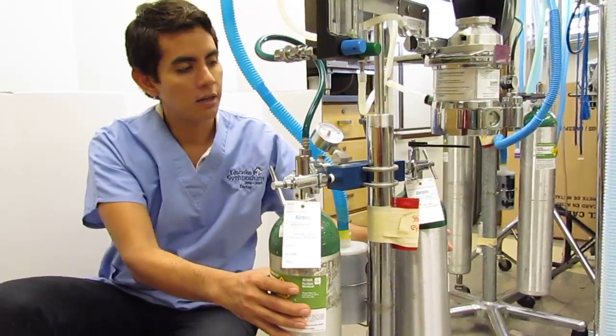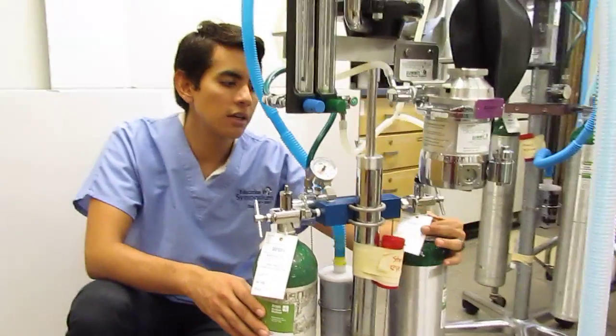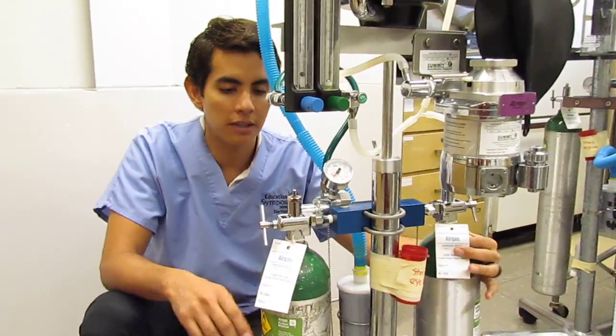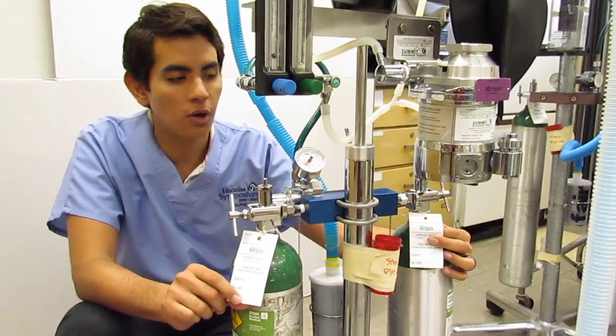You've got two E tanks here. The one on your right is marked as in use by this tab. The one on your left is marked as full.